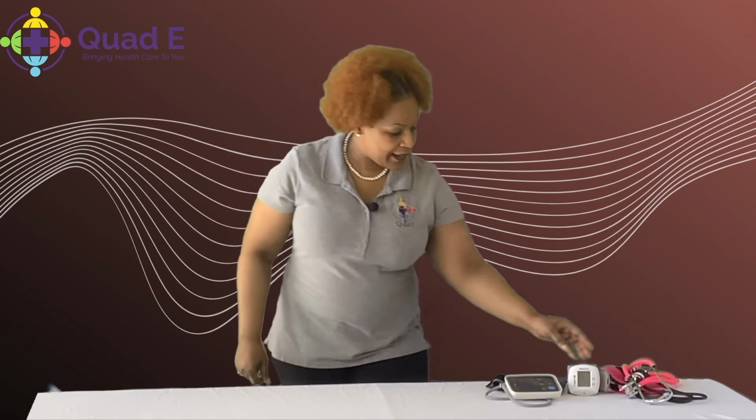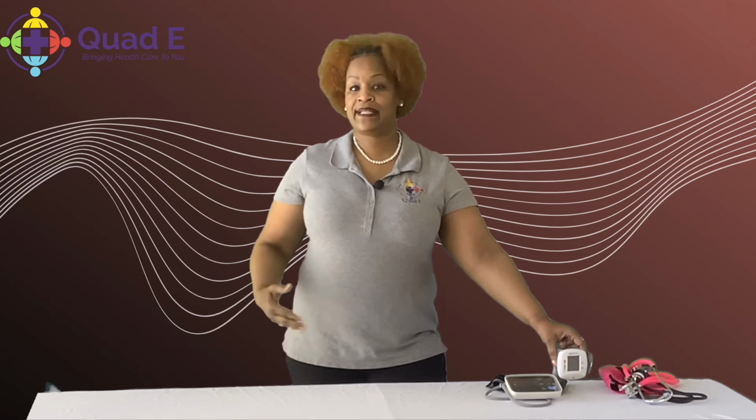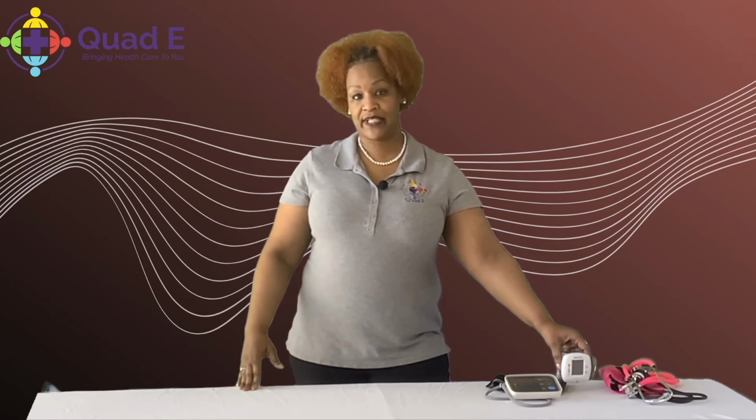Now, one thing that's very important that we want to let you know is that there are different ways that you can check your blood pressure, okay? We have a couple of different ways, and I will give you a demonstration on how to use the one that's highly recommended by the American Heart Association.